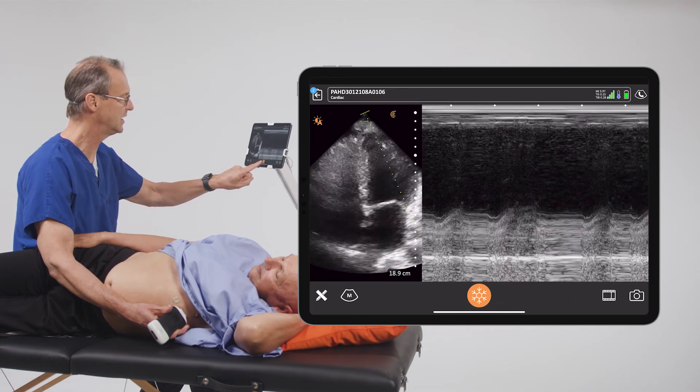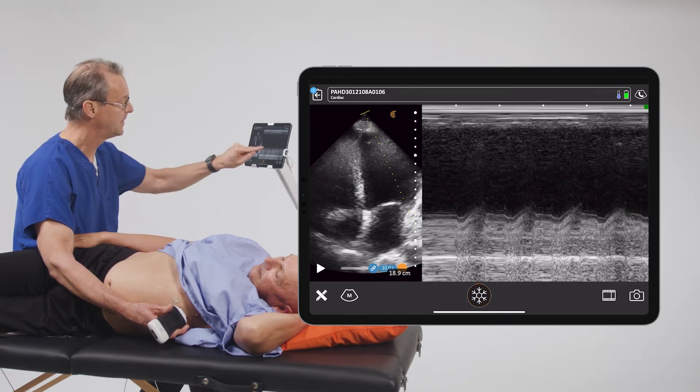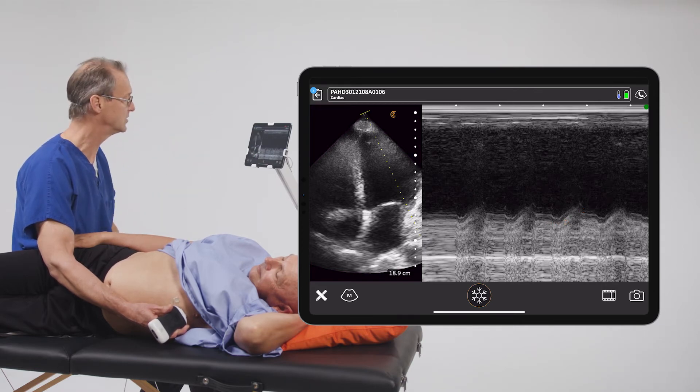When we do get an adequate image, we go ahead and freeze the image. Now we have to measure this distance, and it gives us an indication of how well that heart contracts in the longitudinal plane. So we'll go into our calipers.